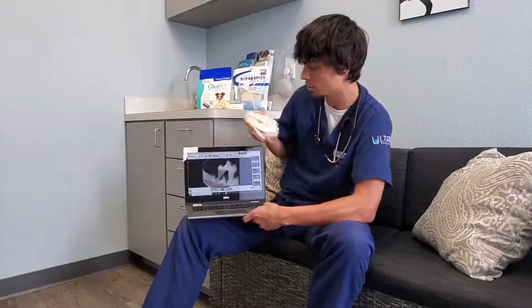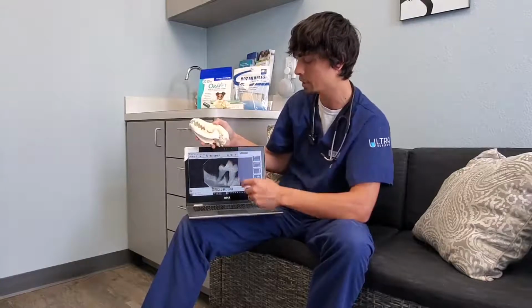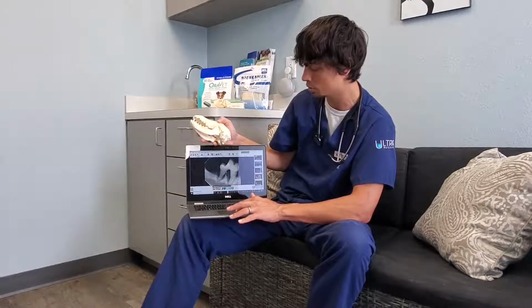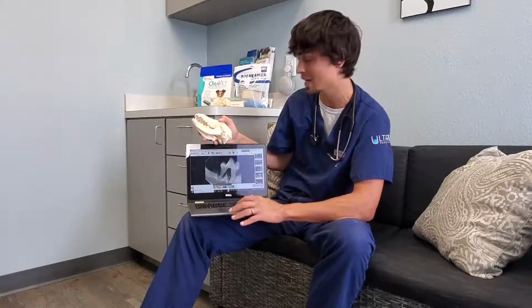And so in this dog here, you can see this is a dental x-ray of this tooth right here. And the periodontal disease is extremely severe in this case, to where the bone surrounding these two roots is almost completely destroyed from the infection and inflammation that's been going on under the gum line for some time.